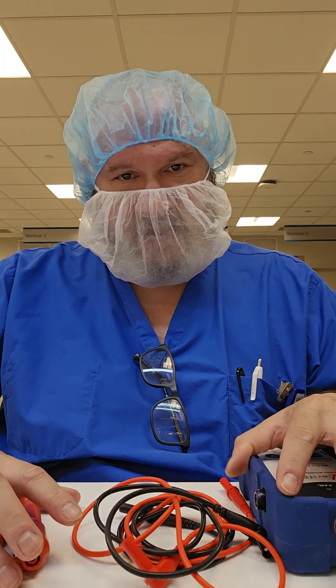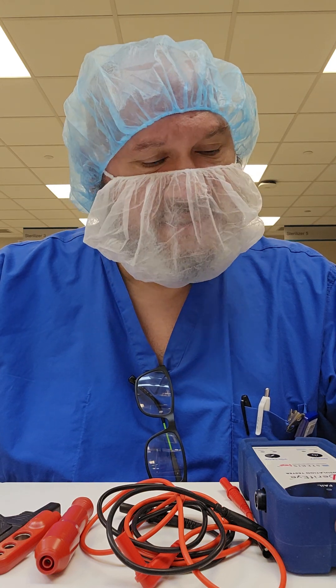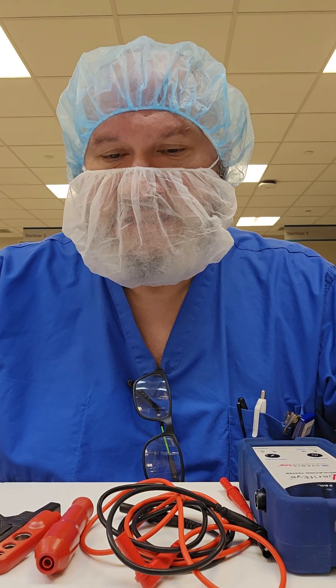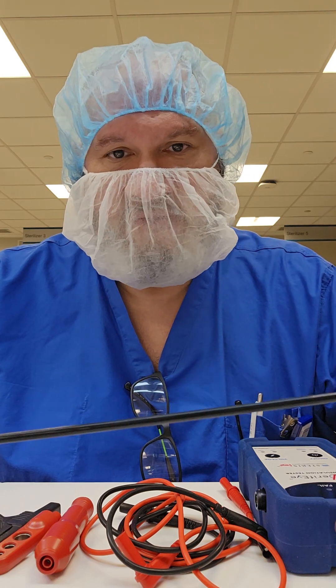What's going on guys? Welcome back to WDYD CSP — What Do You Do as a Central Sterile Processor? You can probably tell by the equipment in front of me that I'm about to start testing insulated instrumentation. These instruments specifically were sent out for repair, and they all happen to be laparoscopic instrumentation.